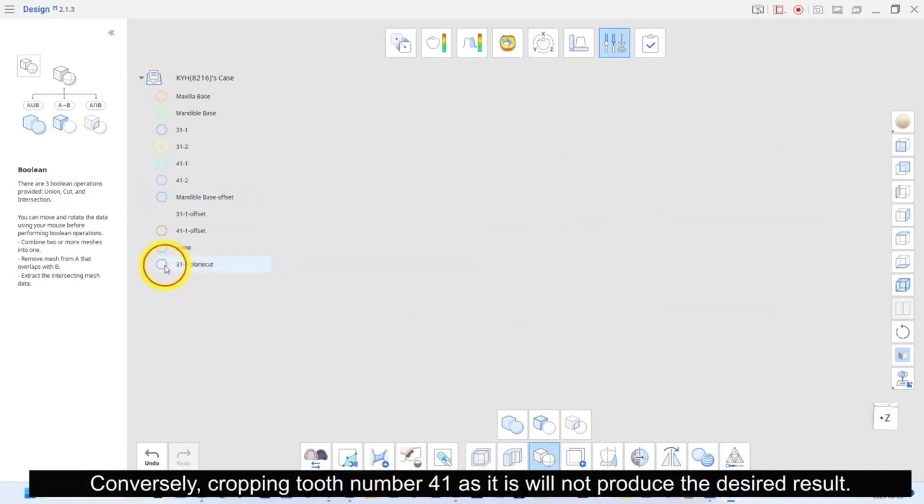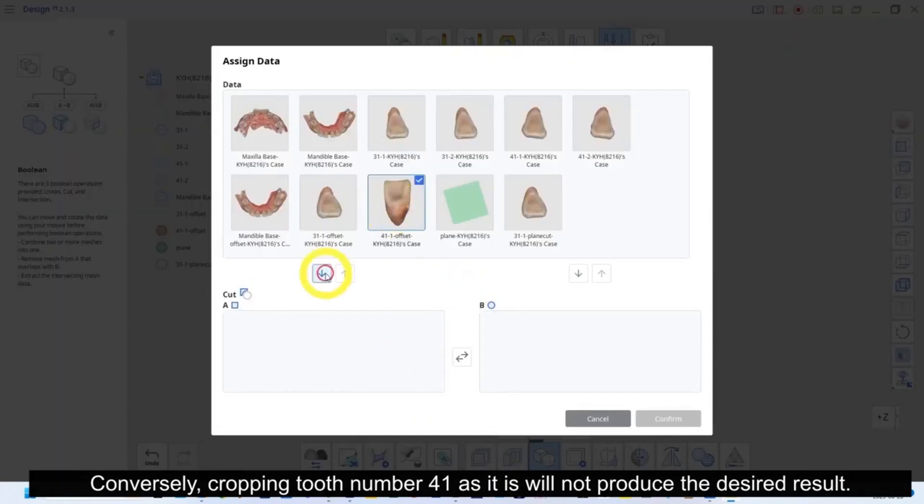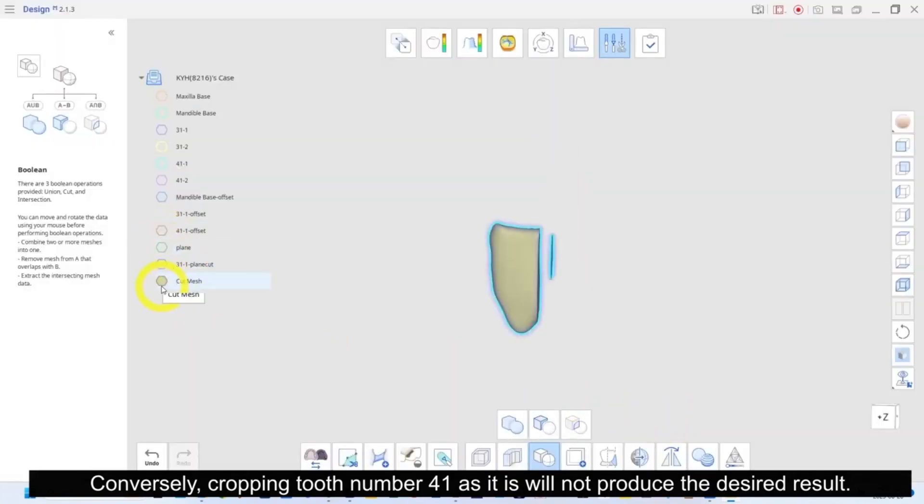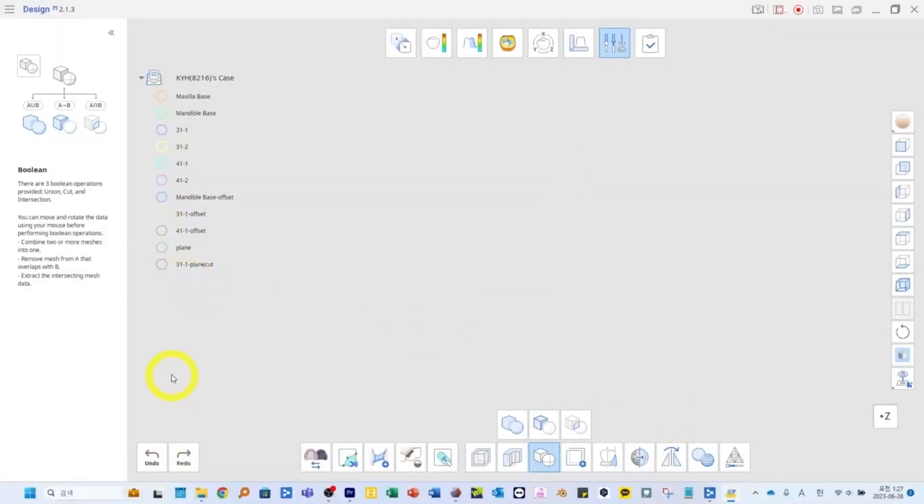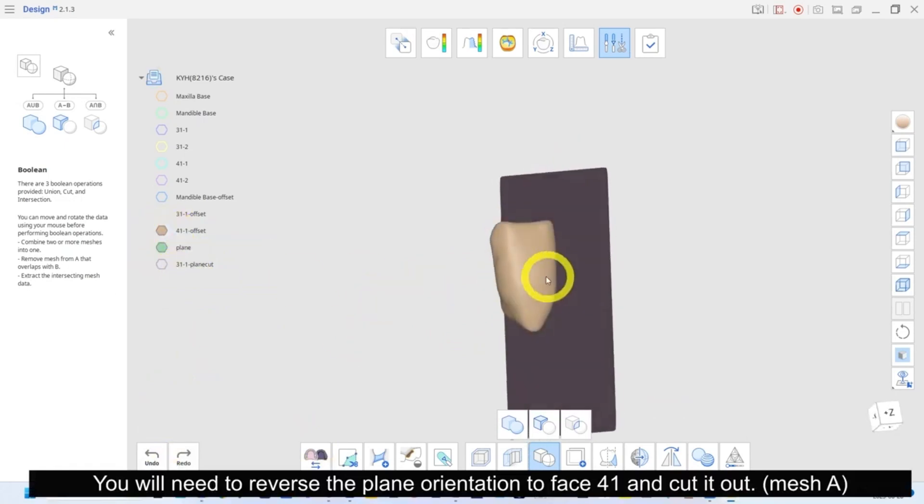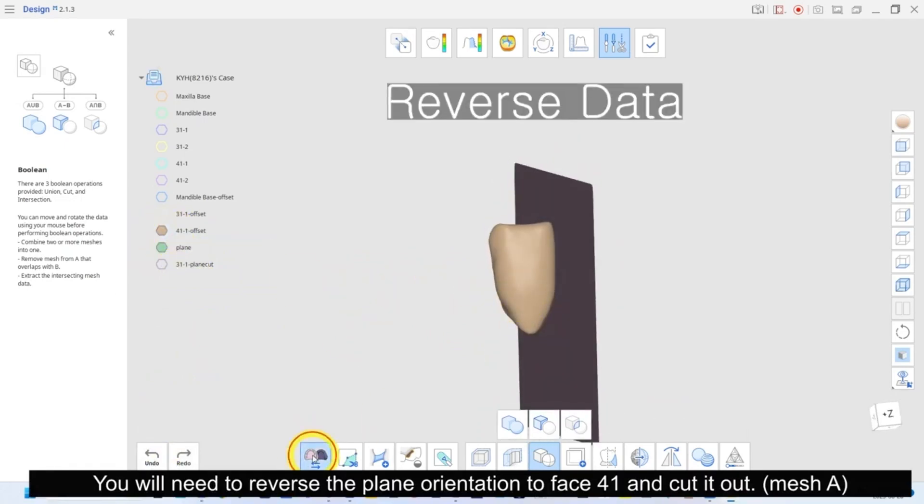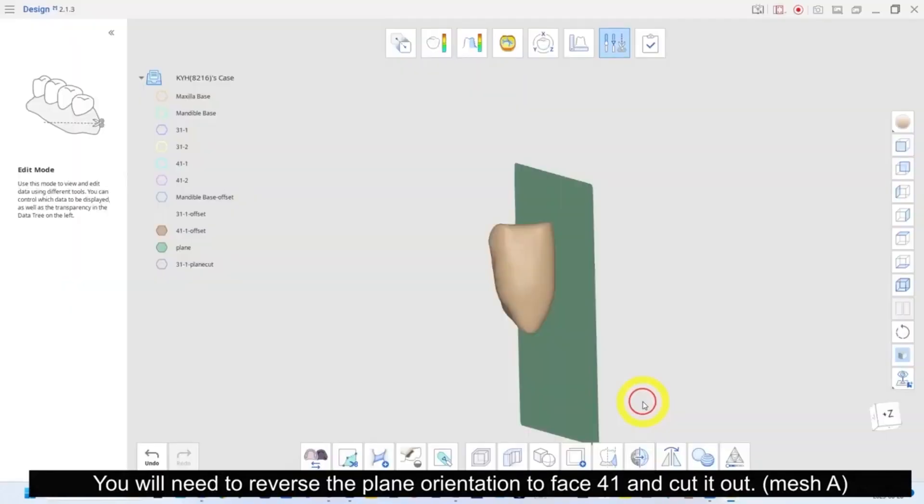Conversely, cropping tooth number 41 as it is will not produce the desired result. You will need to reverse the plane orientation to face 41 and cut it out.